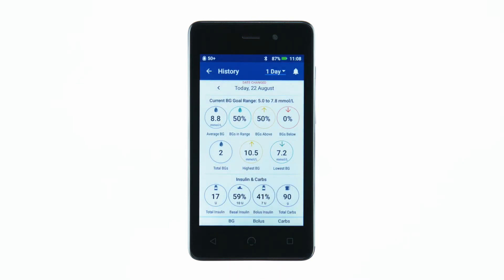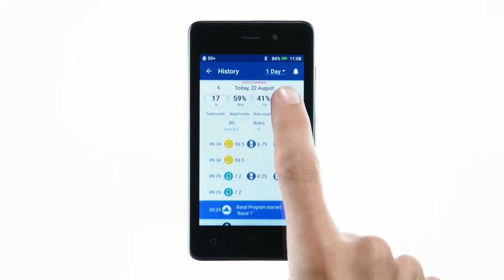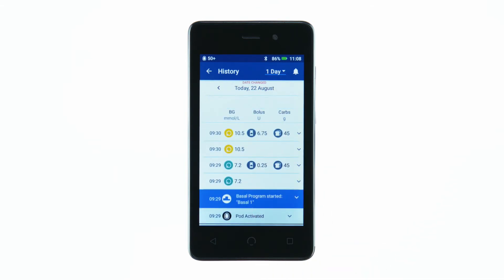From the insulin and BG history screens, you'll see a summary of all data over the selected time period. This data includes a record of carbohydrates entered into the bolus calculator, the time of pod activation and deactivation, any insulin suspensions, and extended bolus details.